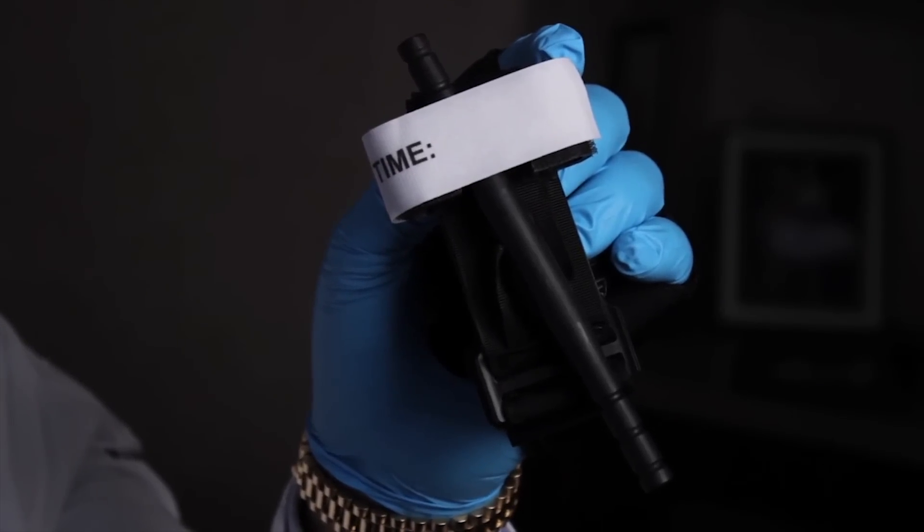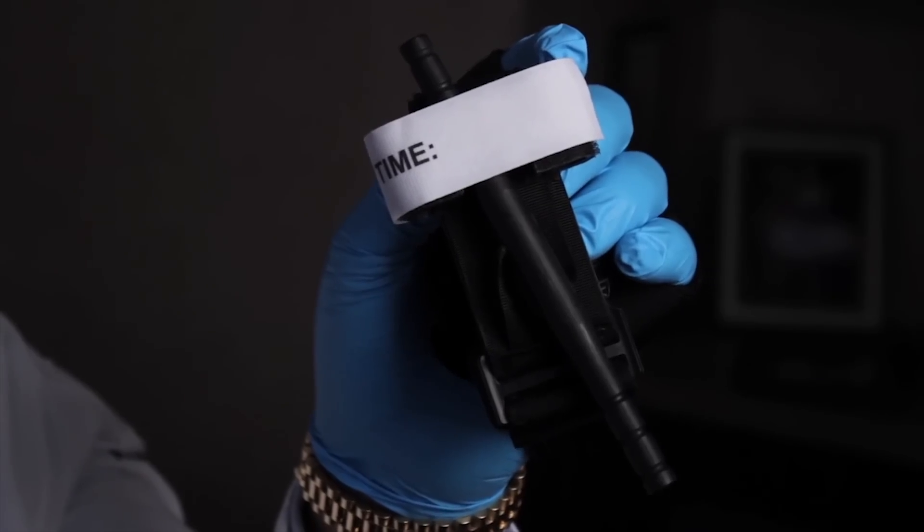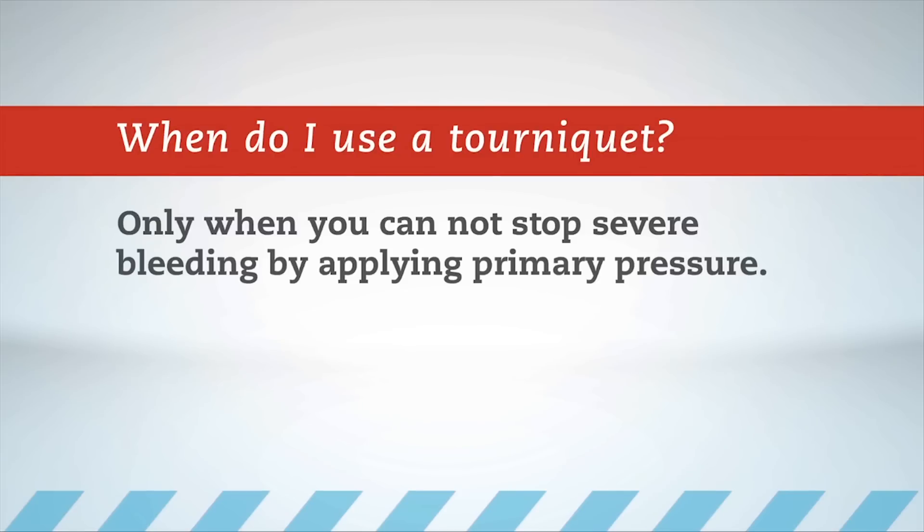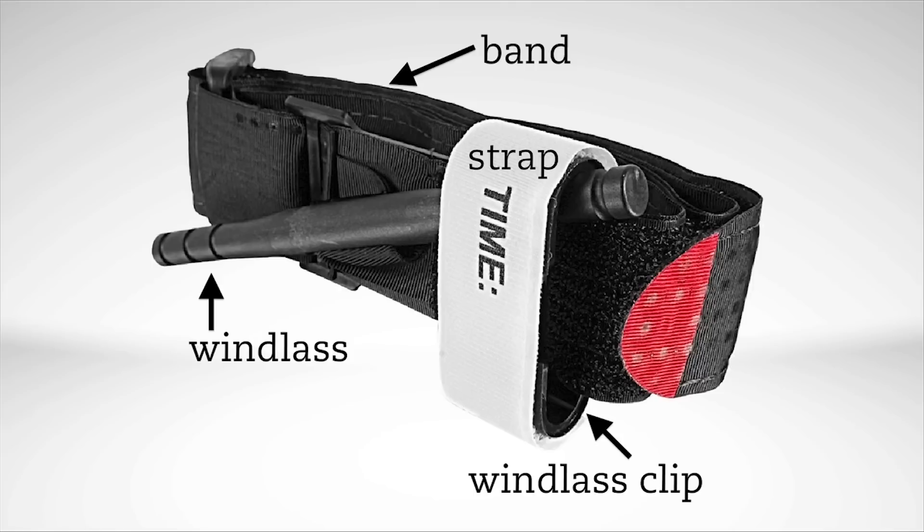This is a tourniquet. In this video, I'm going to show you how to apply a tourniquet. It is important to know when to use a tourniquet — the bleeding has to be severe and not stop with primary pressure. The tourniquet I'll demonstrate has a windlass and a clip. There are four major components: the band, the windlass, the clip, and the strap.